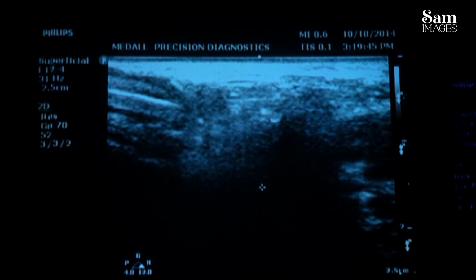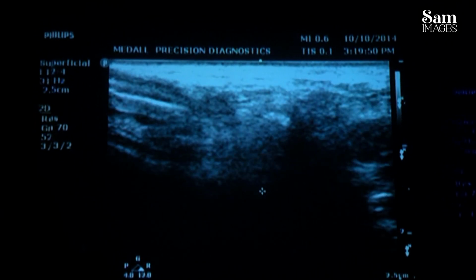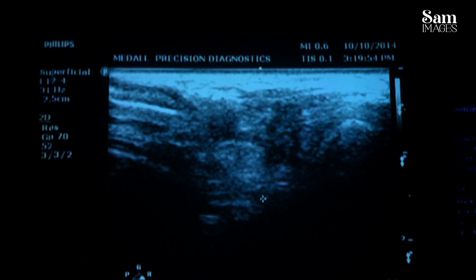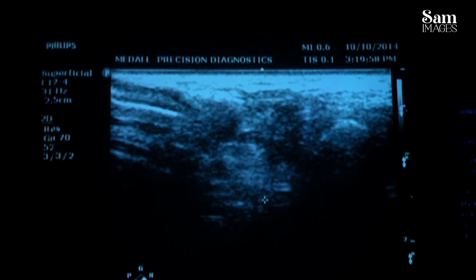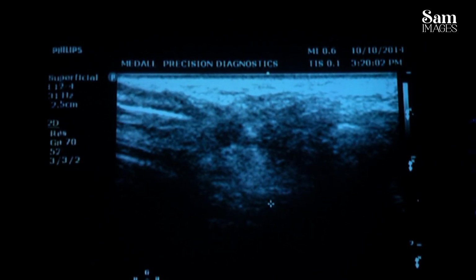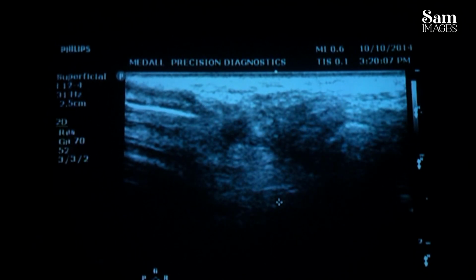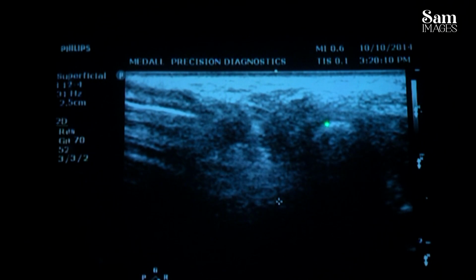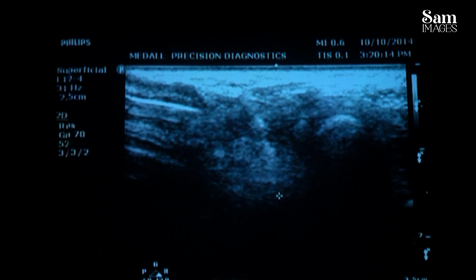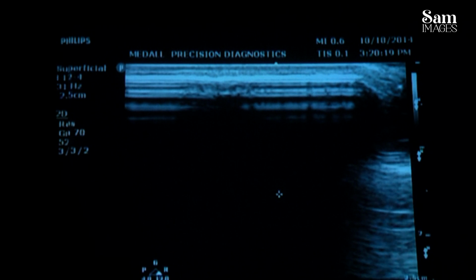See, the contact is maintained, but it is not going out. So that's why I am calling it a subluxation. See, that is typical of subluxation of the temporomandibular joint. The articular disc also has become narrowed. You see that discoid shape, that black one. You just show it. That one. That is the discoid shaped one. That has also reduced here. Okay. See, it is going back there.